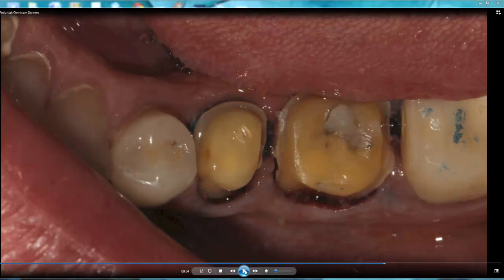So in this case, once again, before I start delivering my restorations, I've been using Prep Start again to clean all the debris or contaminants from the prep, or from the chemicals if we use any chemicals to stop the bleeding. And when I establish the hemostasis all around, again, the Prep Start is going to be the first, and then it depends what I have left from the tooth structure.